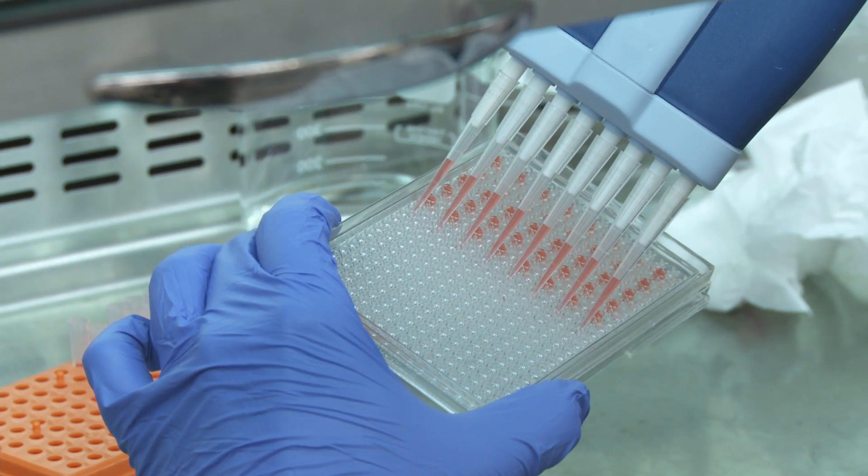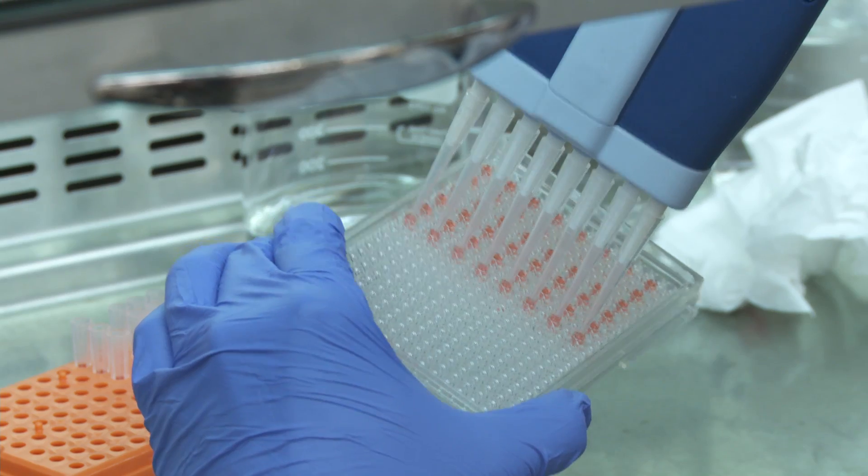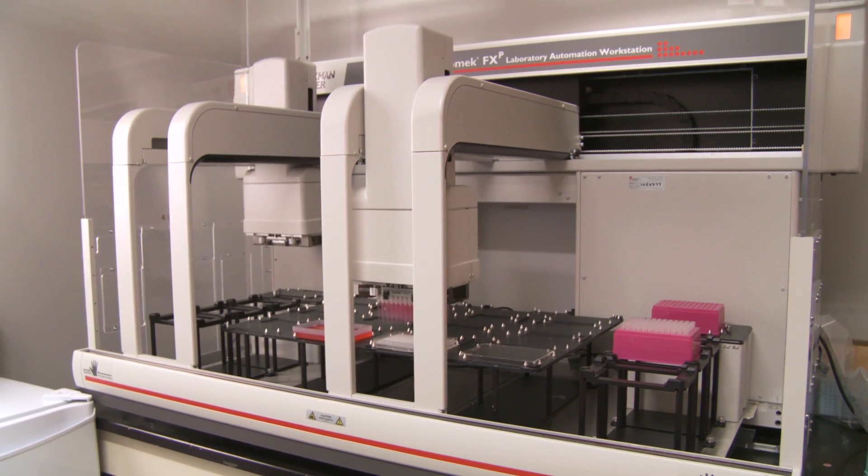Hanging drop plates provide a true three-dimensional environment — it's only the cells and the media, with no matrix necessary. They are simple to adopt because they work with manual pipetting methods that researchers already use, as well as automated liquid handling equipment.